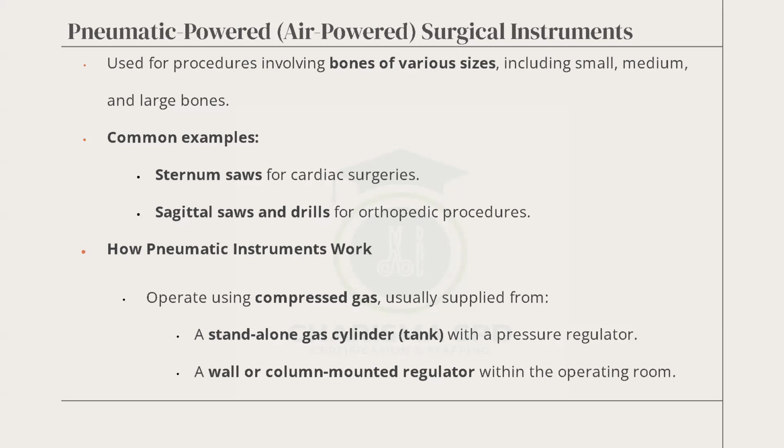Okay. So in my hospital right now, we have one, a dermatome, which also uses that. Dermatome also uses pneumatic power to shave the skin of somebody. All right. How do pneumatic instruments work?